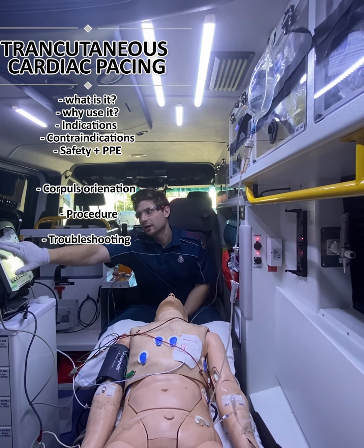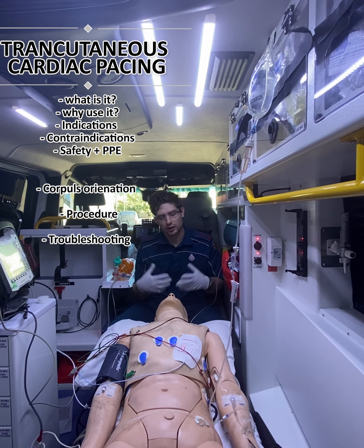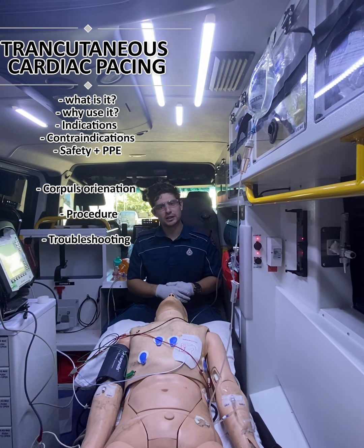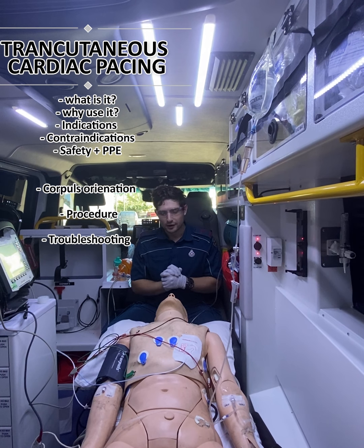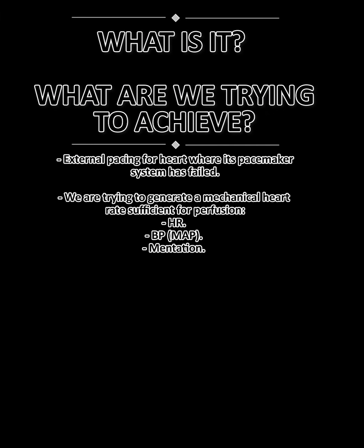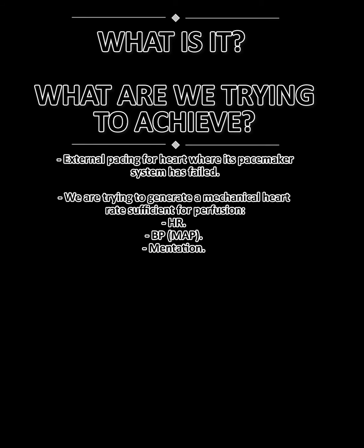I'm an advanced care paramedic working out of Brisbane, Queensland, and today I'm going to be running through transcutaneous or transthoracic pacing. This is not to be confused with transvenous pacing, overdrive pacing, synchronized cardioversion or defibrillation, and all the other methods we have to utilize these pads. TCP is a method where we use an external pacemaker via defibrillation pads to continuously shock the patient multiple times to take over the function of the pacemaker system of the heart because it has failed.